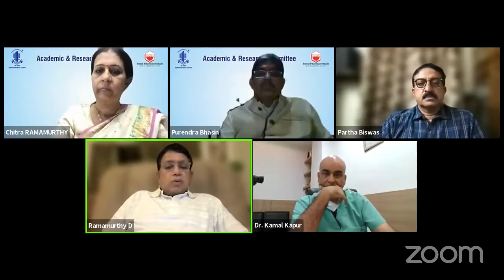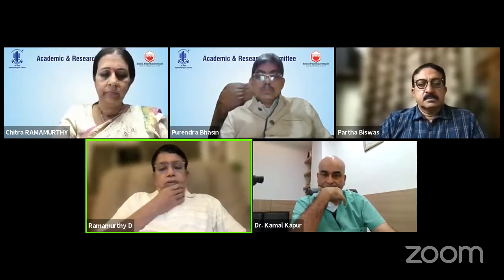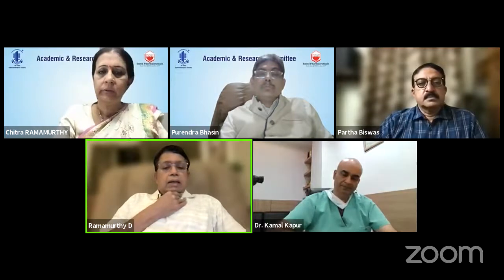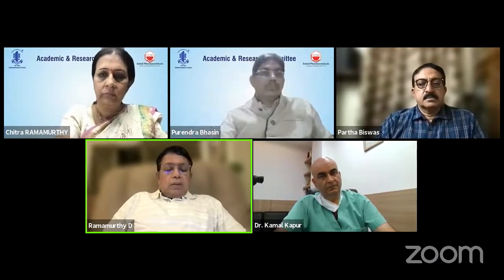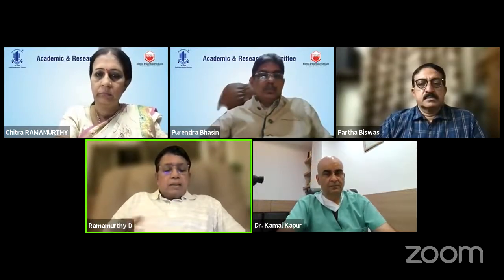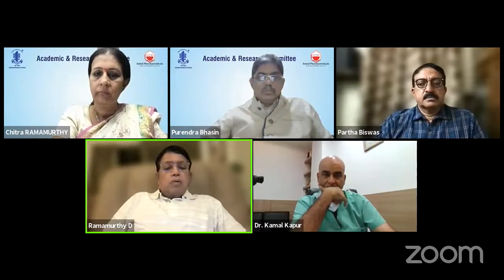So I stick strictly by 2.8, and also give some credence to the angle. If it is less than 30 degrees, then that's again a relative contraindication. But I would agree with most of what Kamal said. Only thing is, even in hyperopic eyes, I am aware of the difference in the profile of the lenses. In myopic eyes, it's basically plano-concave, while this is plano-convex in hyperopic eyes. And it's slightly thicker in the periphery. But still, we stick to 2.8 millimeters.